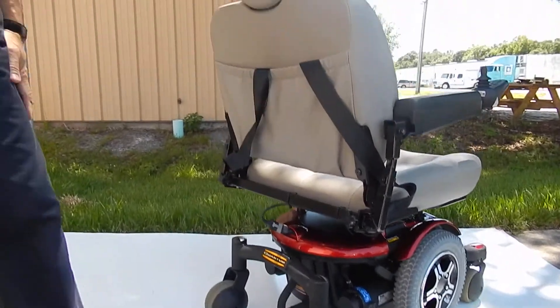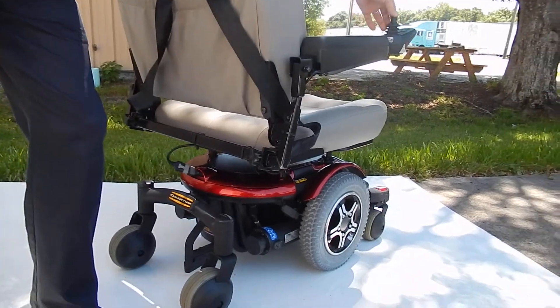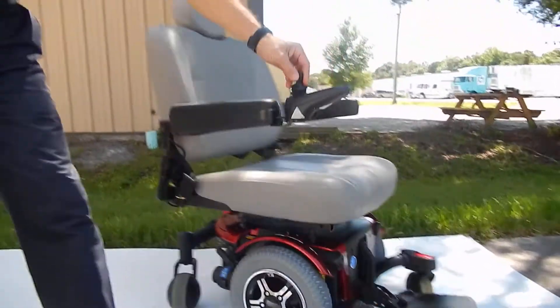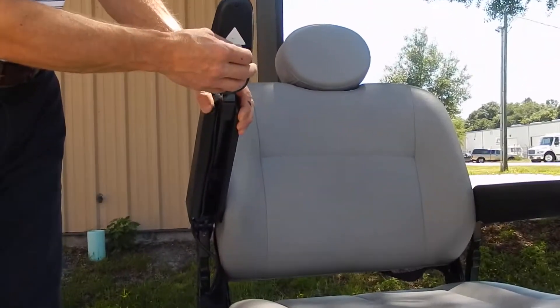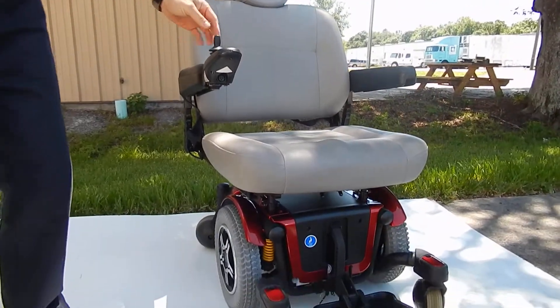This chair has a pouch in the back. It has a charger that comes with it, and the charger will plug right in front of the joystick here. You plug the charger in and plug it into the wall, and once it's full, the charger will stop charging.